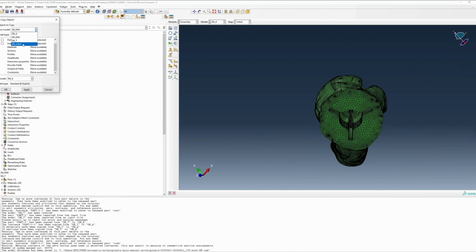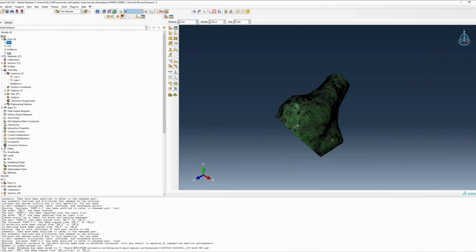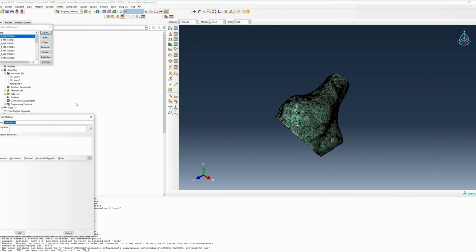Here, I like to copy over my original implant part from my resection procedure, but if you're analyzing press fit or if it's easier for you, then bringing in a new implant STEP AP214 file is also acceptable. Now that we have a full material applied bone model ready to go, we can start setting up our analysis. Begin by assigning property and sections to your new implant. Here, I'm assigning titanium properties and Young's modulus of 110,000 megapascals and Poisson ratio of 0.3.